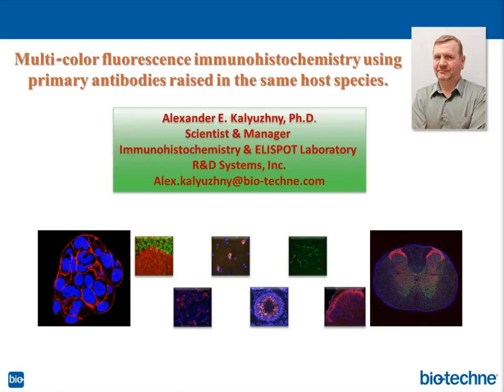On cells, usually we do a 30-minute incubation, but cells are a different story because cells are dispersed and there's no need to give more time for better penetration of the secondary antibodies into the tissue, like when we do immunohistochemistry. So this is faster. With tissue sections, it depends on the antigen.